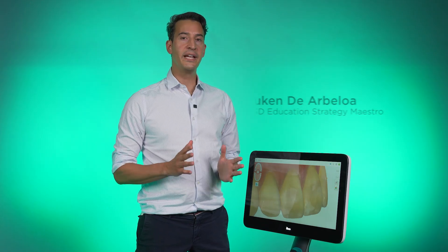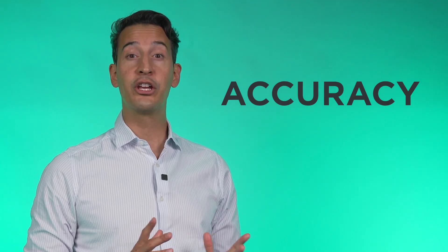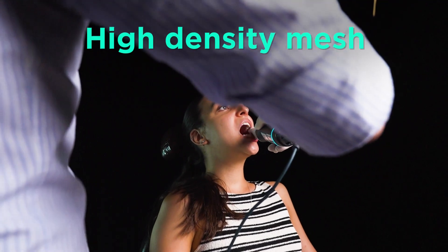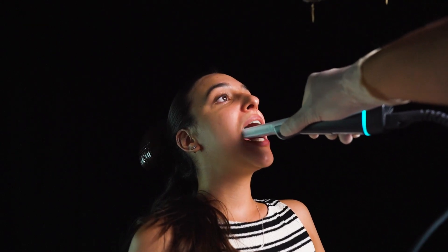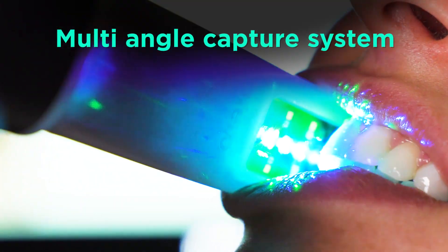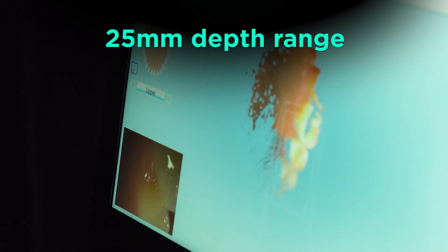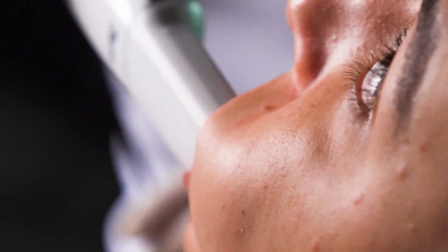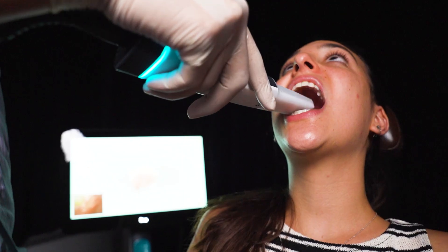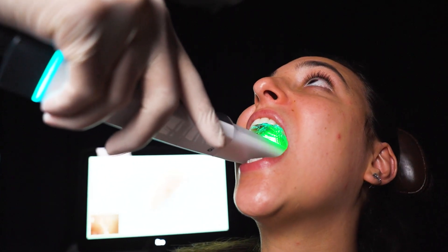We chose the Aetero Lumina because it gives us what matters most in restorative dentistry: accuracy. Its high-density mesh captured tooth anatomy in stunning detail, on par with the top scanners in the world. Thanks to its six cameras, multi-angle capture system, three times wider field of view, and 25 mm depth range, we get incredibly precise data even in the most challenging areas — exactly the level of detail we need for our new natural restorations library.